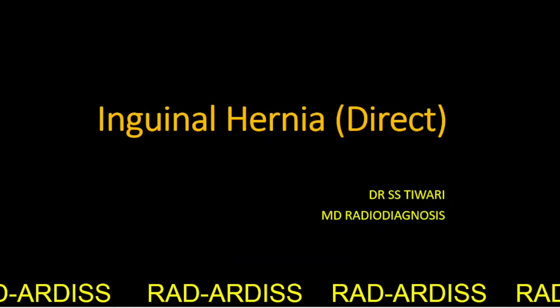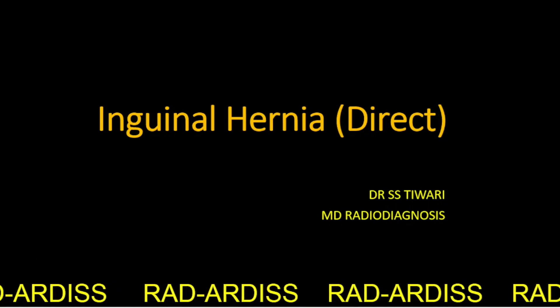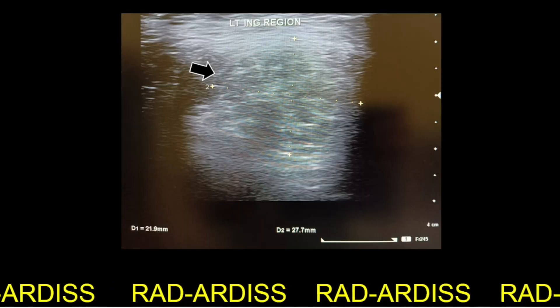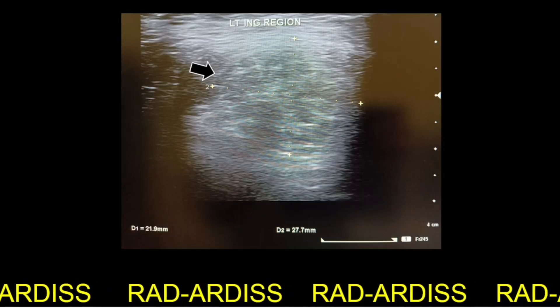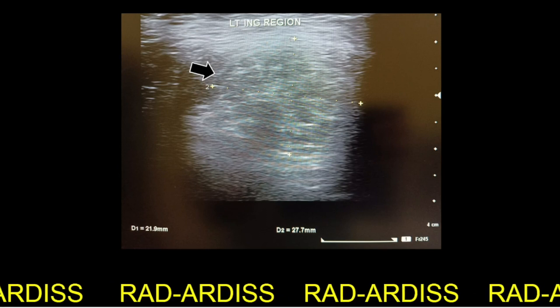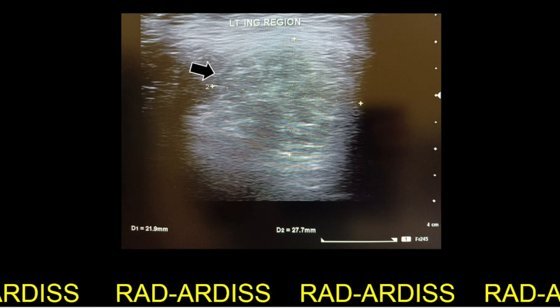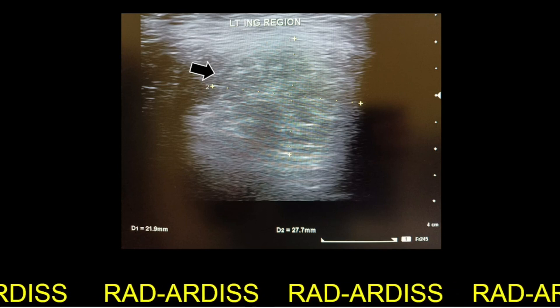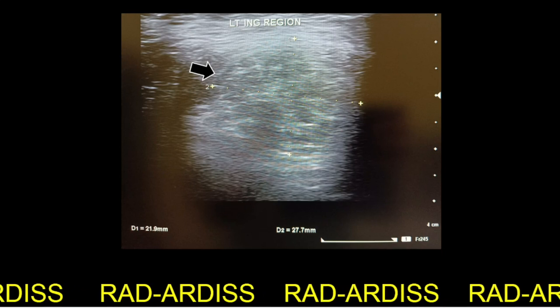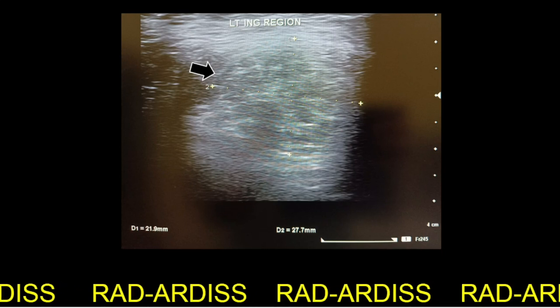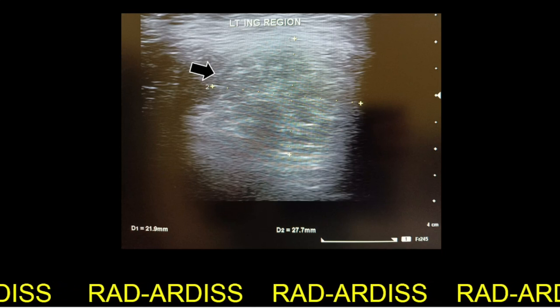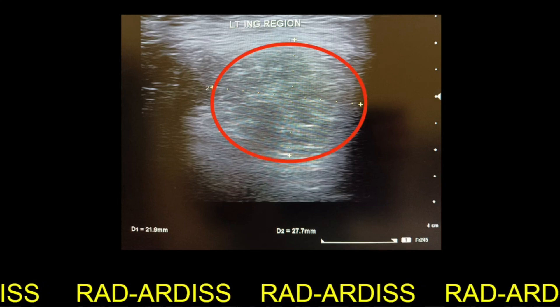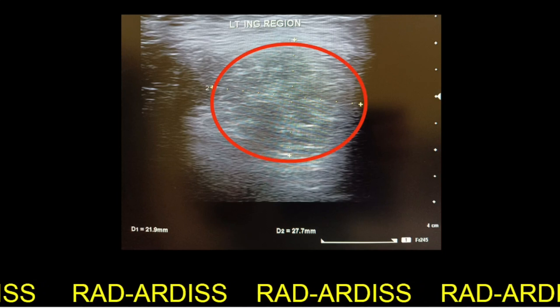Inguinal hernia, direct. This is the transverse ultrasound image of the left inguinal region of a patient where we can see an isoechoic swelling in the inguinal region, which is rounded in shape.